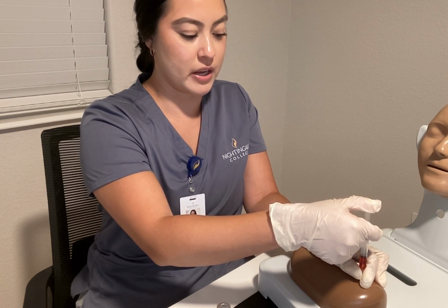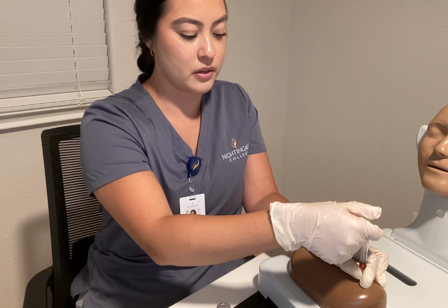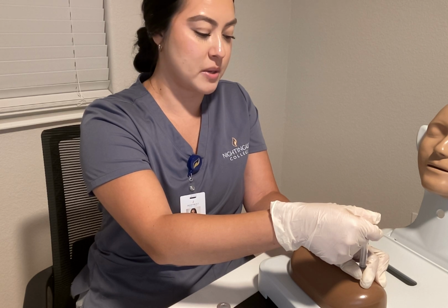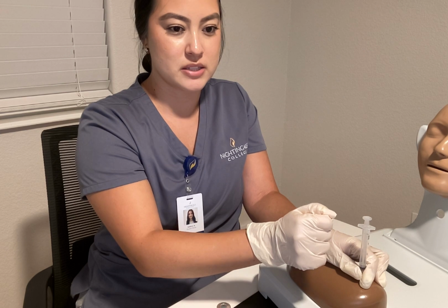We are injecting the medication at 10 seconds per milliliter. Once that injection has been completed, we're going to leave the needle in for about 10 seconds.